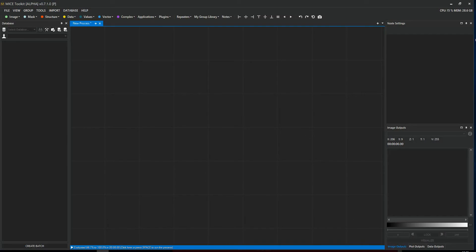Hello and welcome to this tutorial in Mice Toolkit. In this video, I'm going to show you how to import data from disk directly into the workflow.